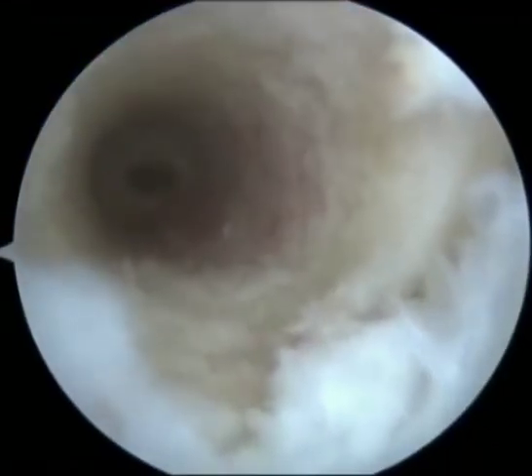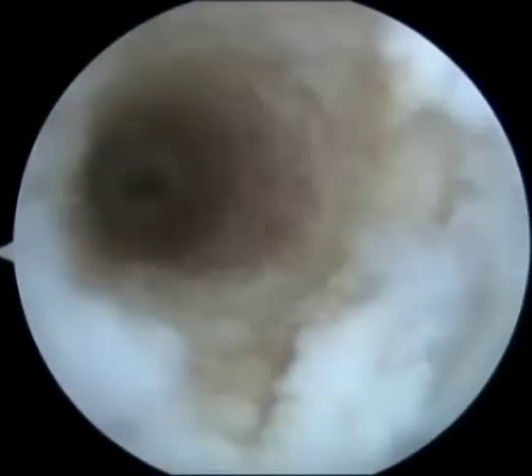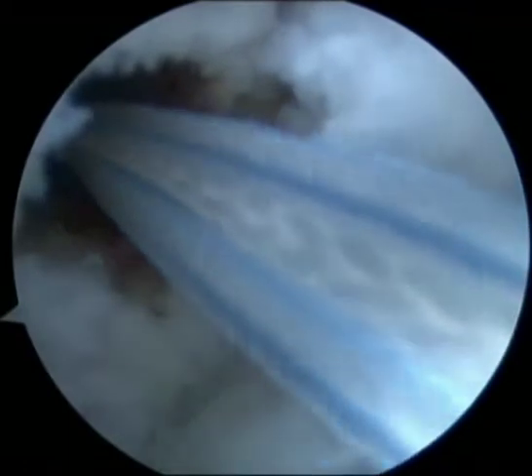Femoral socket has been prepared via the anteromedial portal. This is the end-on view of the femoral socket, and the guide pin hole in the cortical bridge is seen in the center.